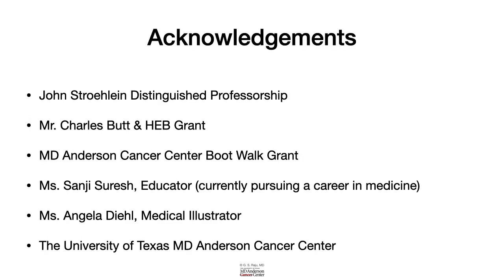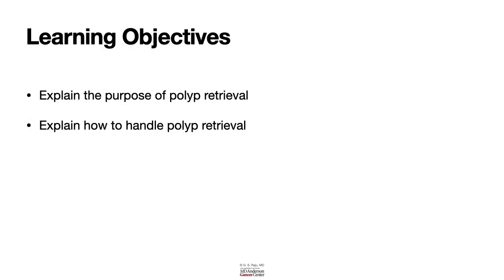These are my acknowledgements, and today's learning objectives include: 1. We will discuss how to retrieve polyps depending upon the size and how to handle the process.